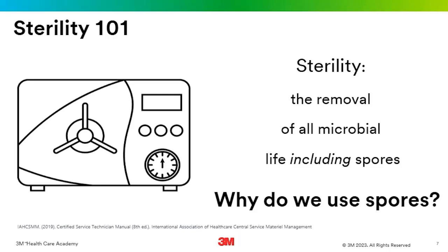And the fight against microbials and bioburden is everybody's responsibility, not anybody else more in decon and not anybody less on assembly or prep and pack. It's an entire movement of professionals working together. Because when we put the instruments inside of those autoclaves, be it steam or chemical, we are fighting to create the conditions necessary to destroy spores. And in sterile processing, here comes the big word, ready? In sterile processing, we destroy Geobacillus stearothermophilus. Don't worry, you won't have to spell it, and you probably won't get quizzed on it later unless you're going to take your certification test.